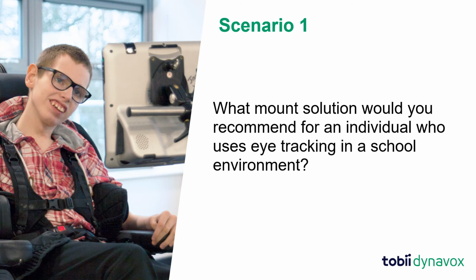Other questions might be, where will they be using that device in the classroom? Is there enough room in the classroom to use a floor mount? They may be in one class all day, but due to space limitations, a table mount may be the best choice.